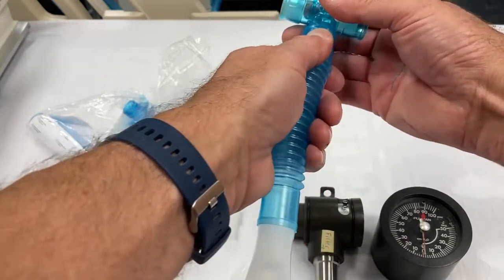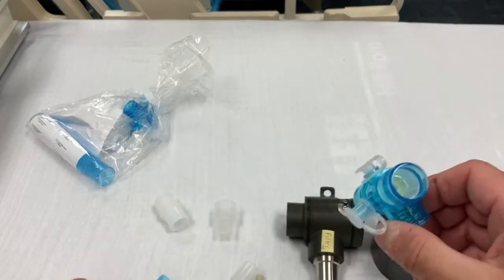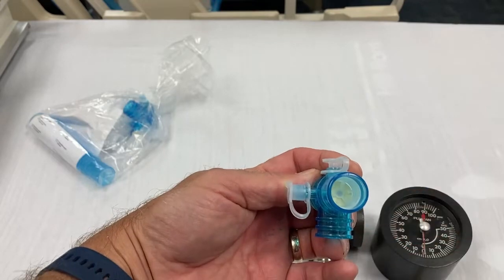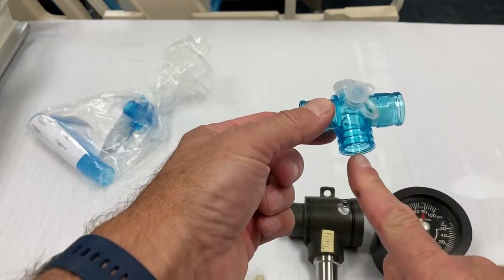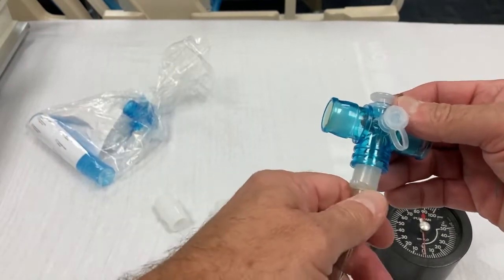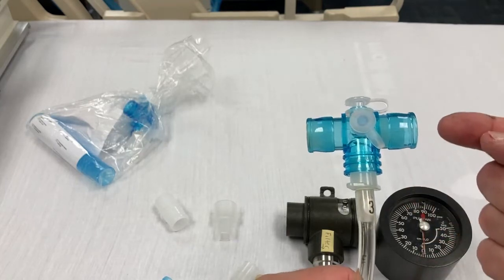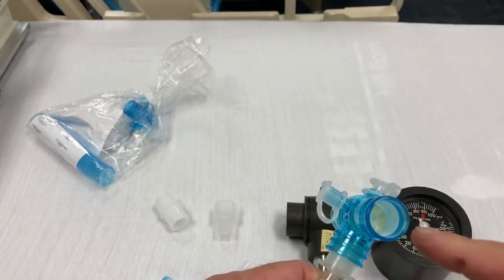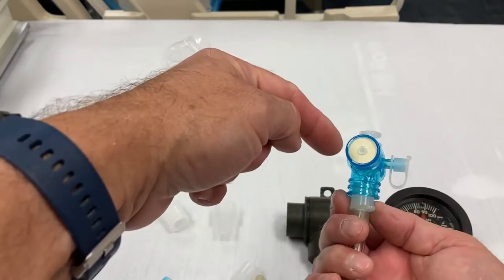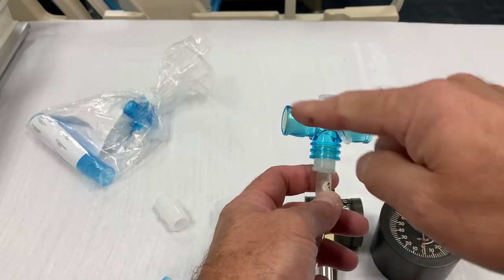But we are doing an intubated patient. So these have two valves. One is on the outside and one is on the inside. And so think about, we hook the ET tube to the port here, and when they breathe in, air is going to come in through this side because the one-way valve is on the inside, and it can't come in through this side because the one-way valve is on the outside. So when they breathe in, air is going to come in this side but not this side.